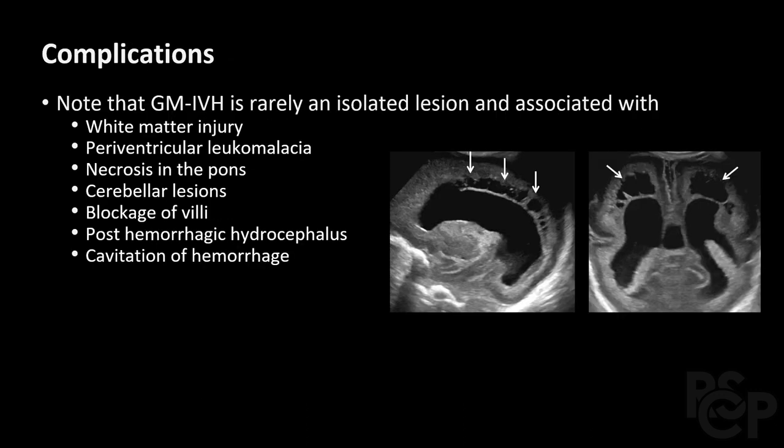There are many complications. It is important to note that germinal matrix intraventricular hemorrhage is rarely an isolated lesion and is associated with white matter injury, periventricular leukomalacia, necrosis in the pons, cerebellar lesions, blockage of villi, post-hemorrhagic hydrocephalus, and cavitation of hemorrhage. The image on the left shows how periventricular leukomalacia can be cystic, and the enlargement of the ventricles shown is chronic, secondary to white matter volume loss.